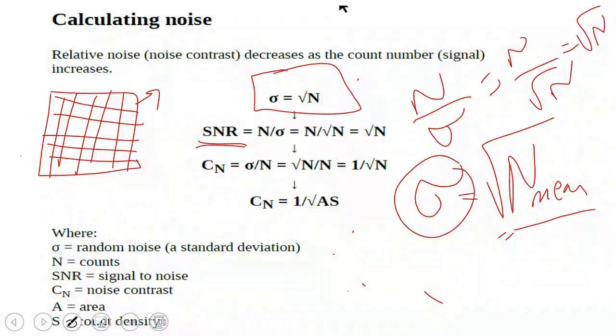For example, the signal-to-noise ratio is used in specific cases if you want to see a lesion in a certain shape or location, while the contrast-to-noise ratio can be used with low contrast detectability lesions. Each one has its own specific use, but the details may not be very relevant to you.